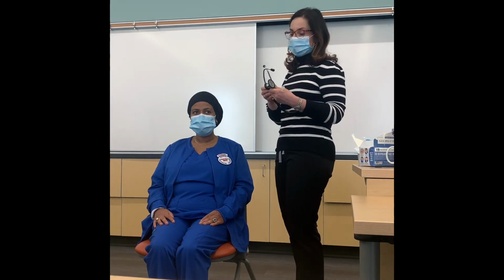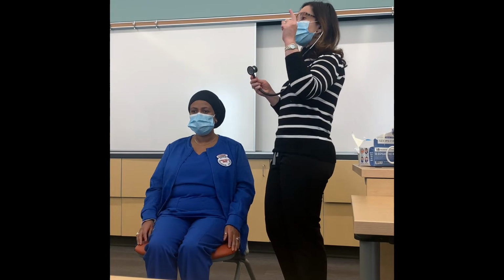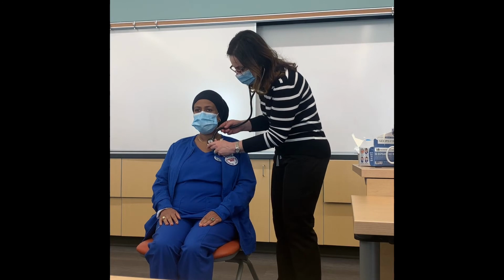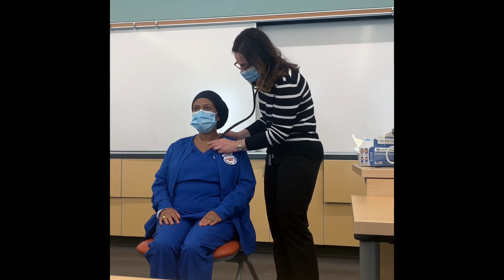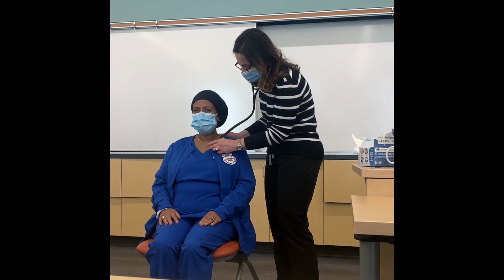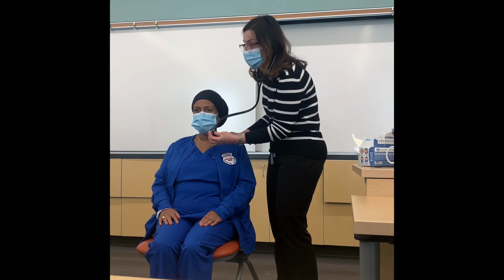And so the other thing you have to remember to do is you ask your patient to take a deep breath in and out, and you are listening with the stethoscope for the entire duration of the inspiration and expiration. So I'm gonna start here because it's easy for you to see. Normally I would start here. So go ahead and take a deep breath in and out. And out. And so I am listening for the entire cycle.